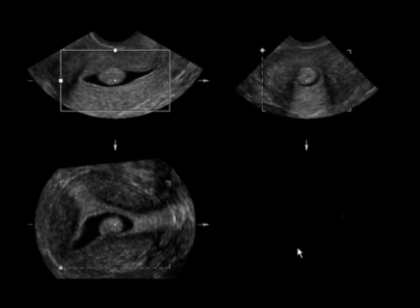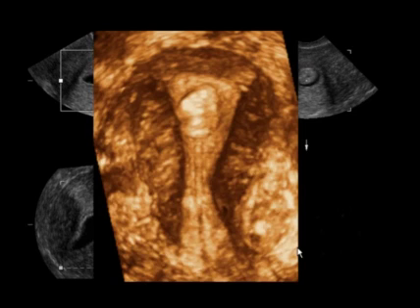And here is what happens when you have a polyp inside the cavity. You can see the dot is on this little polyp, which is inside the cavity and well surrounded by fluid. You can also render the inside of the cavity and demonstrate that polyp on the coronal view. And here we're also actually seeing part of the catheter that is inside the uterine cavity.